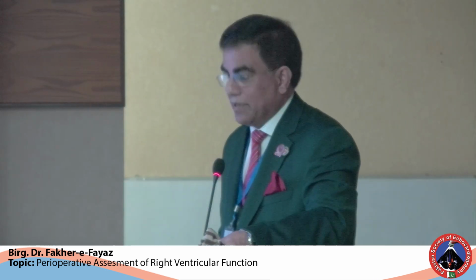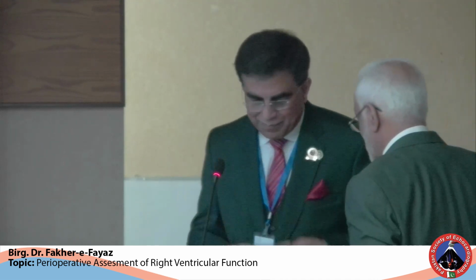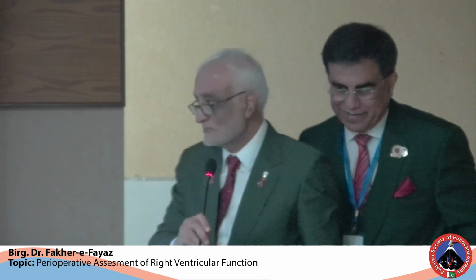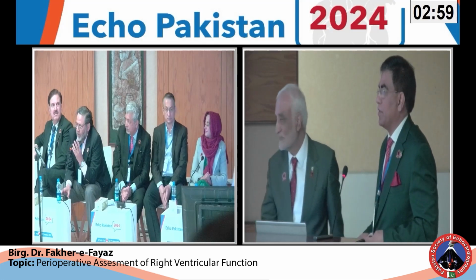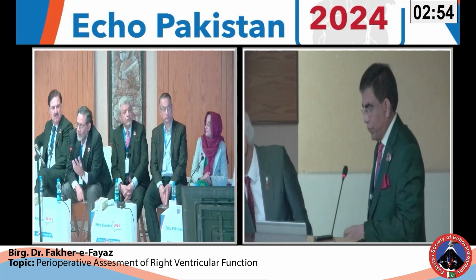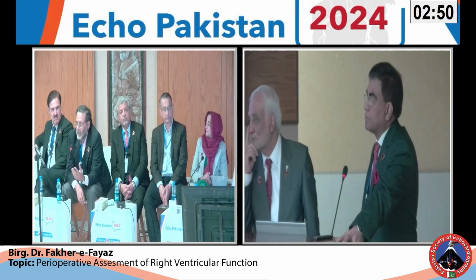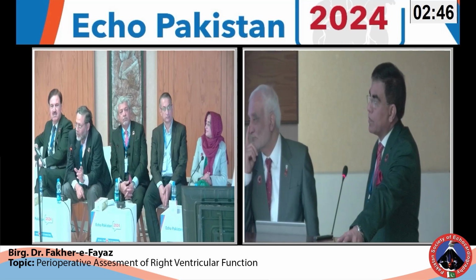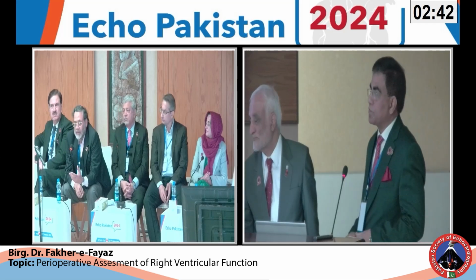I think there was a time when we cardiologists used to go to the ICU and evaluate these patients, but now our cardiac intensivists are doing the job. I think once you're assessing a patient after the bypass or an operation, then you have a privilege to have a look at the previous report. Most of these patients have got echoes which were done pre-operatively, and whether RV size was normal or abnormal, and was there any hypokinesis or hyperkinesis. So you have an advantage.